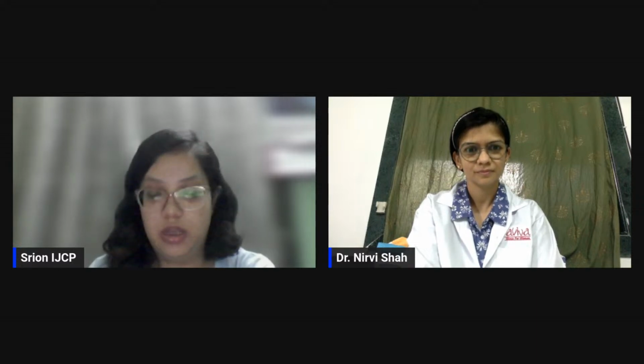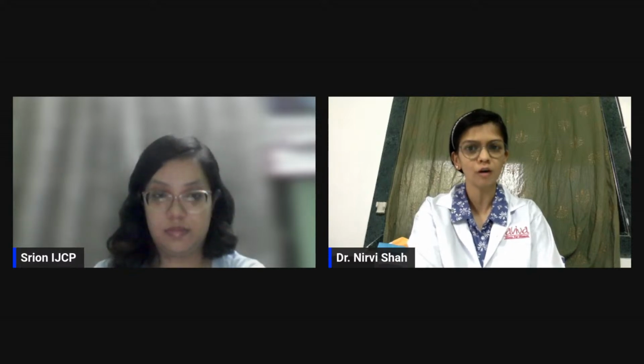So, ma'am, the first question is, what are the potential benefits of incorporating artificial intelligence into ultrasound diagnosis for menstrual disorder? Yeah. So the potential benefits are, like I said, in adenomyosis it becomes operator dependent. In fibroids, many times it becomes operator dependent. So then it becomes more streamlined, and the chances of error are reduced and there is a main protocol. That is the main advantage of having AI in USG for menstrual disorders.